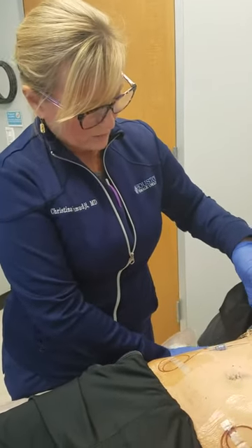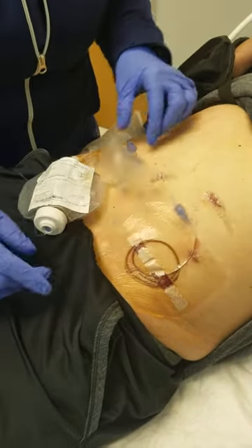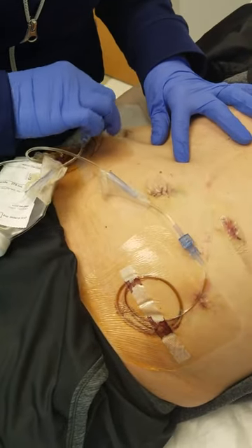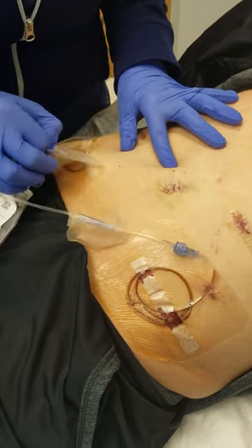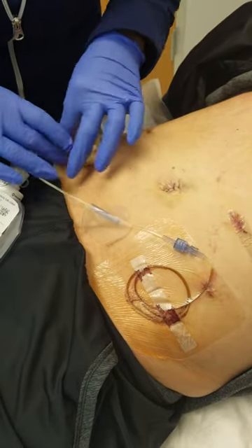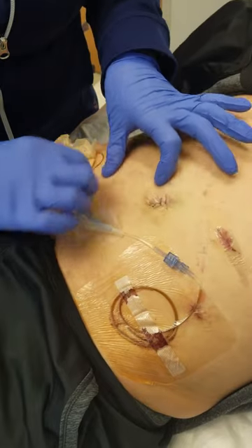So what we're going to do is go ahead and remove these tegaderms. Usually the worst part is just all the tape. She's got four little incisions and the typical bruising that we see after the surgery. Everything looks just right — she's a little bit bloated, and that will happen sometimes. So that's untaped, and then this is a little steri-strip we're going to take off.